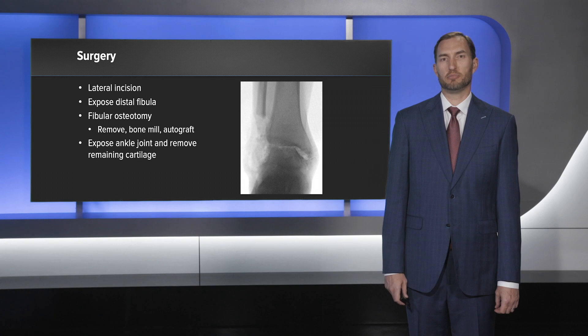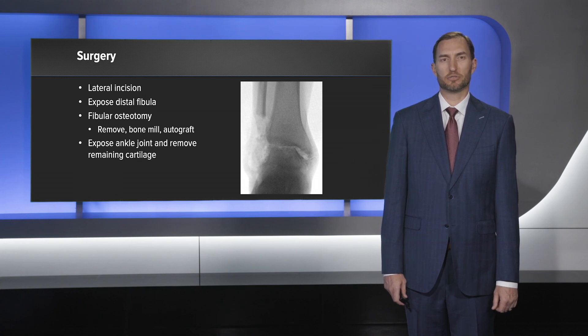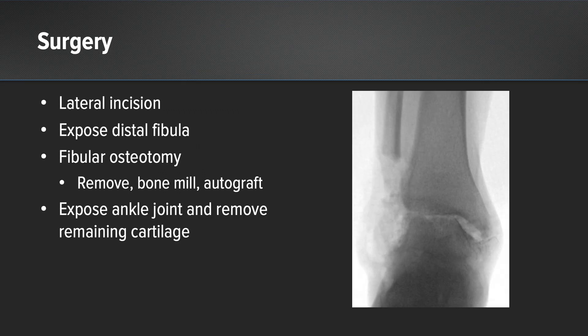The distal fibula was then exposed and a fibular osteotomy was performed. The fibula was then removed and because I didn't need a strut graft, I just placed it all in the bone mill and ground it up to have a great source of autograft for my fusion site.